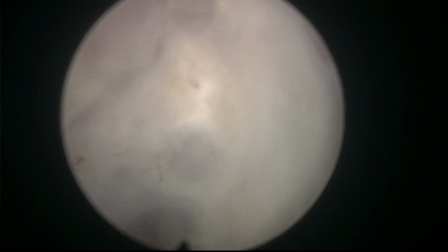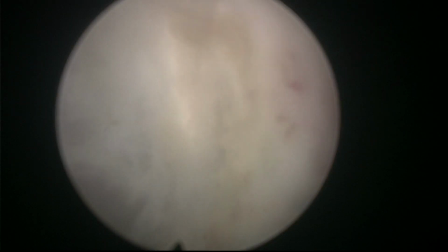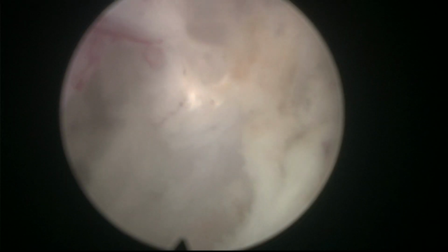Here there is possibly some adenomatous tissue there. So I'm going to just incise here, following the white line, you see, trying to get all the adenomatous tissue out. But of course, what I'm trying to gain is some access to get to the proper plane, which seems to be behind this. This is a nodule there. You see, we don't want to leave it attached to the capsule.